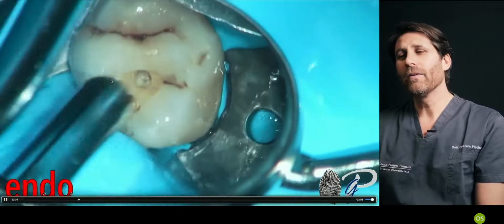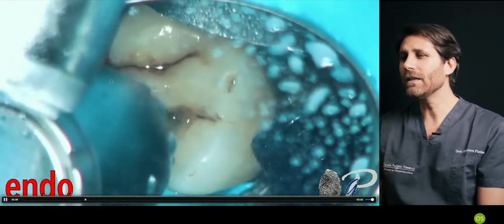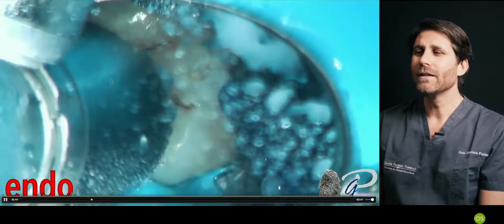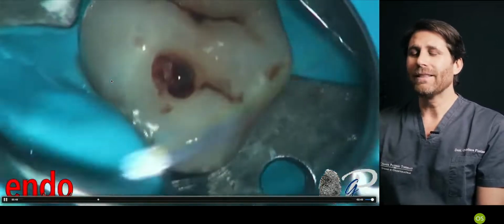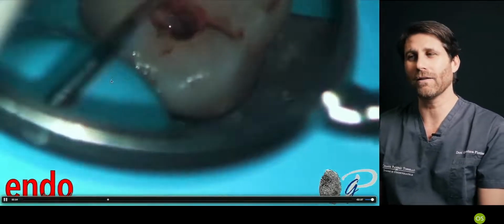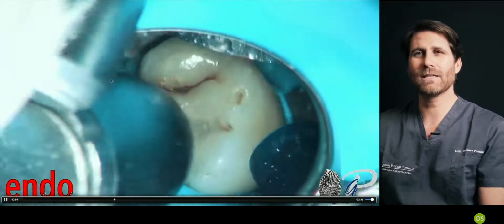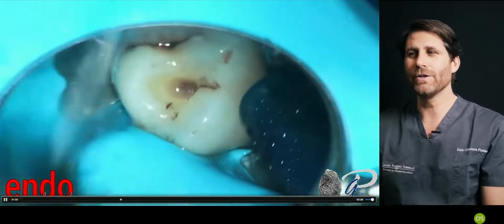So we will see we only use very few burs to open the access cavity with very delicate movements, just trying to maintain as much tooth structure as possible. Maintaining as much tooth structure as possible doesn't mean to be as small as possible on the occlusal surface, but as small as practical. That means we want to have the visibility and the accessibility, some principles that we will see in detail during this course.